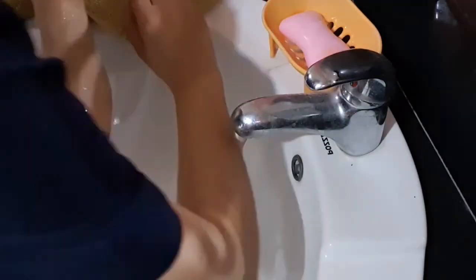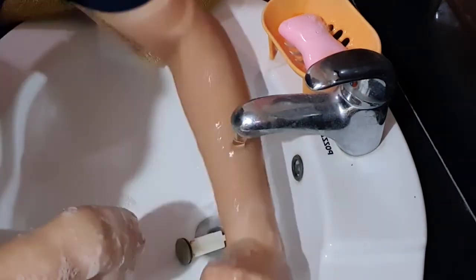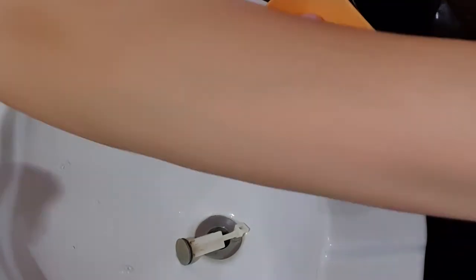Then I will now perform hand hygiene, and will be documenting the data. So that's all. Thank you so much.